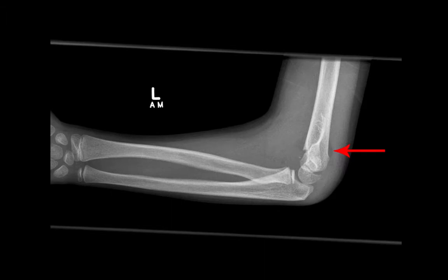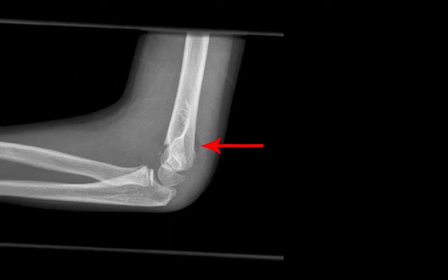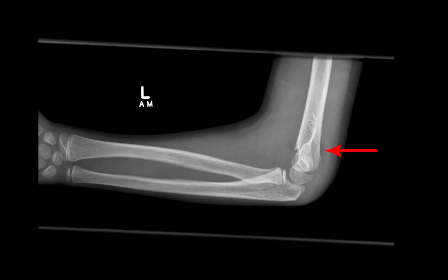We also look for a posterior fat pad sign and we can see one here indicated by the red arrow. Unlike the anterior fat pad, these are almost always abnormal in at least 75% of cases. If you see a posterior fat pad in a sore elbow, think fracture.